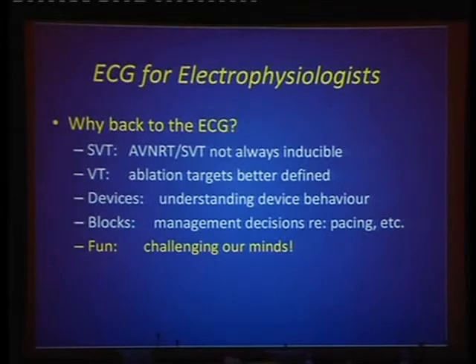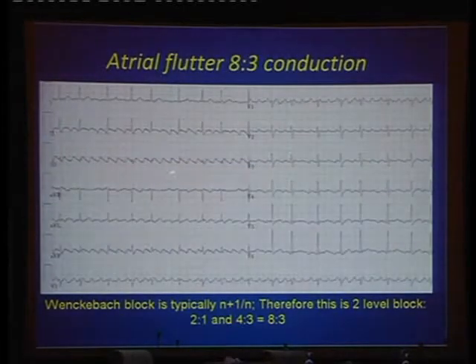And lastly, because it's fun. We shouldn't ever forget that one. We want to challenge ourselves. We want to make this fun for our colleagues and our students and our seniors. We want to look at ECGs that show, for instance, atrial flutter with 8-to-3 conduction and ask ourselves the question, why is that?